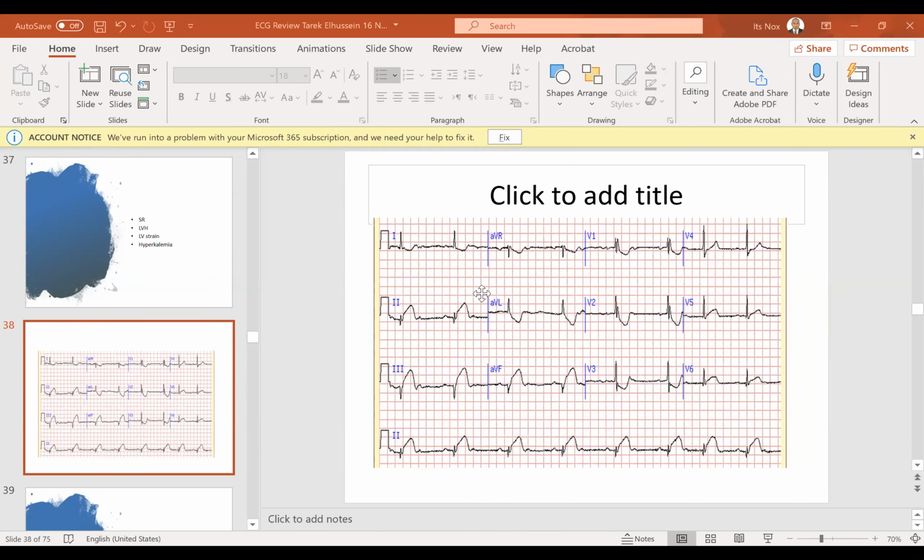Maybe elevated also if it is LAD type 3, which is wrap around the apex. The patient presents with anterior and inferior. Yeah, if you have an anterior MI and there is a wrap around type 3 LAD, so as the LAD is wrapping around the apex, the closer it gets to these are lead 3 and AVF.